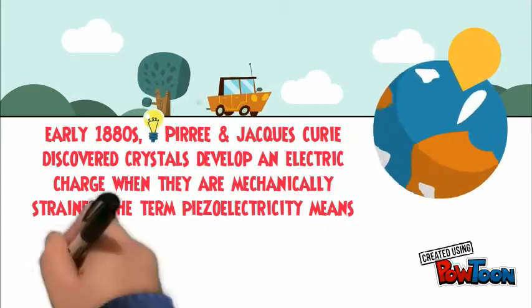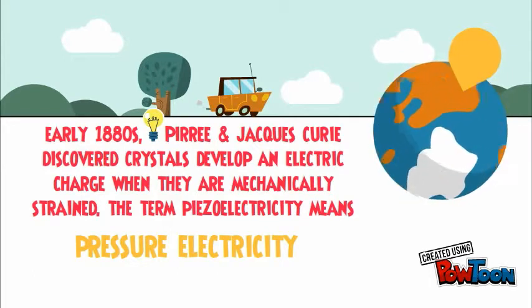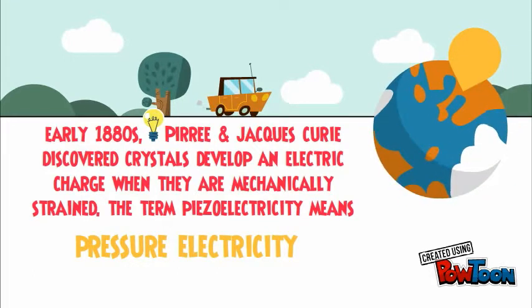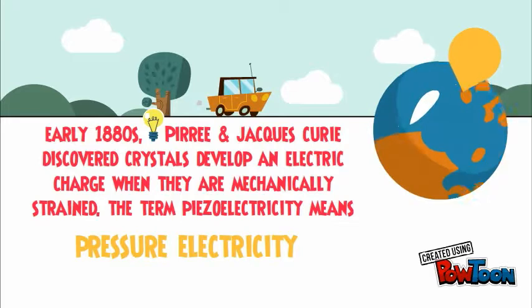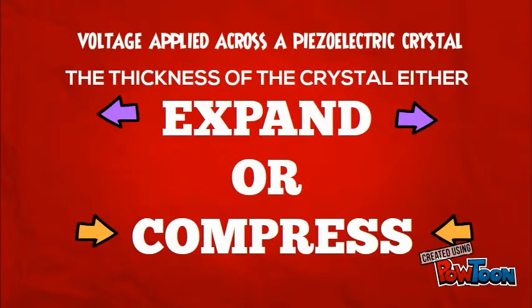In the early 1880s, Pierre and Jacques Curie discovered that certain crystals develop an electrical charge when they are mechanically strained. The term piezoelectricity means pressure electricity. When voltage is applied across the piezoelectric crystal, the thickness of the crystal either expands or compresses depending on the polarity of the voltage and the molecular configuration of the crystal.